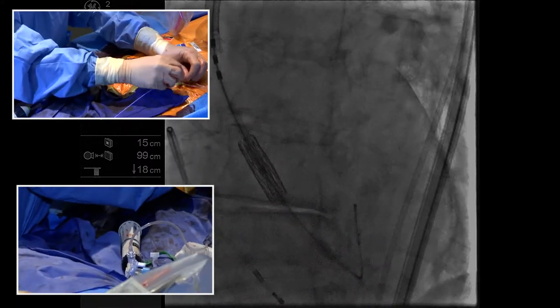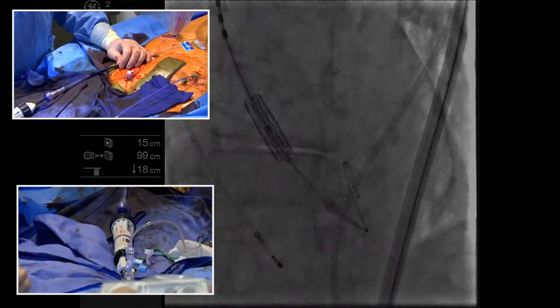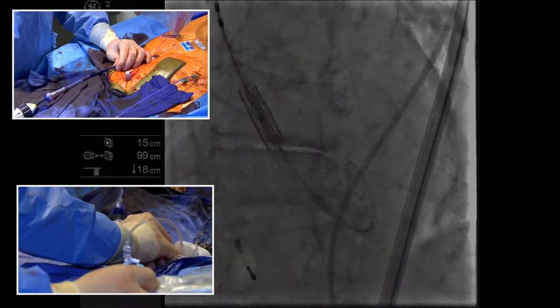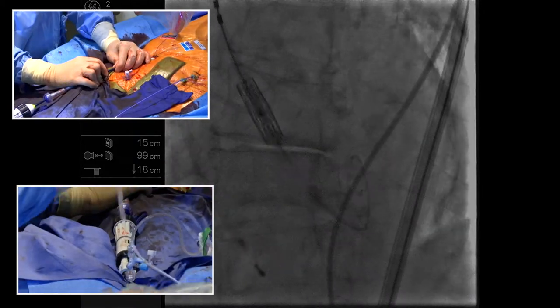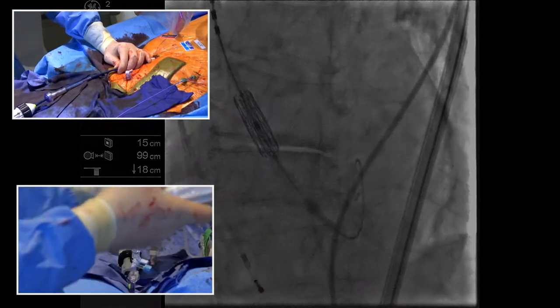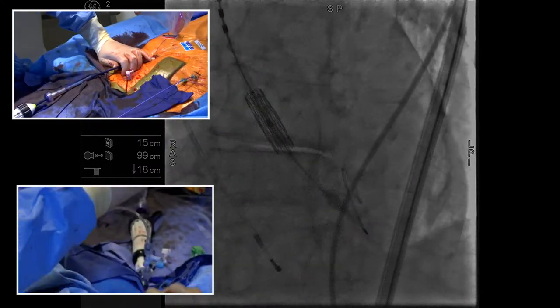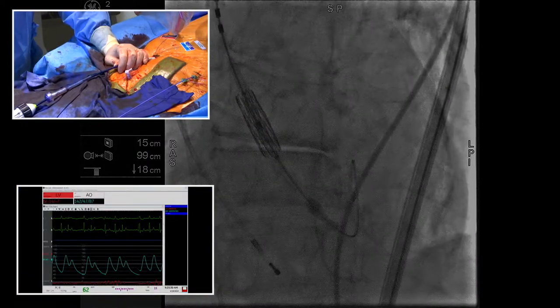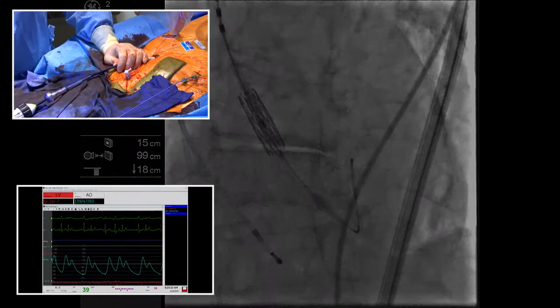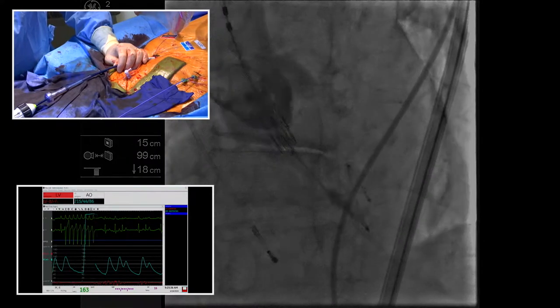I'm going to put my pigtail down, and let's do a little test to see where we are. Okay, it's actually not bad. We're going to do a test right now before we deploy. We're going to pace. You're set there? Yes. Okay. Pacer on. Pacer off. Store the fluoro.